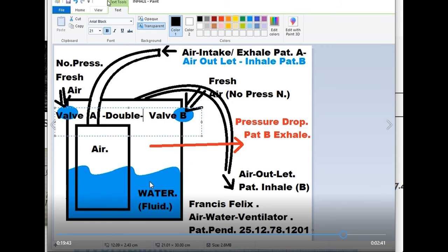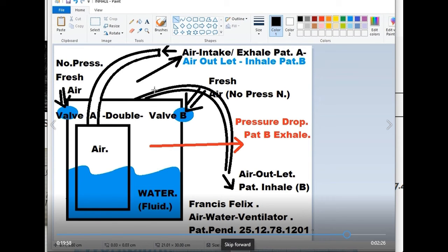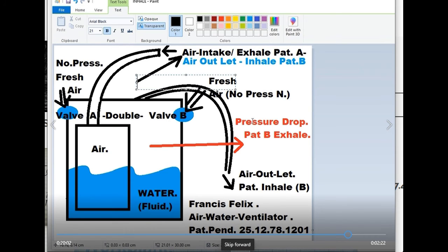And especially the magic is about the floating air. That's what the whole thing is. That means you don't need a lot of machinery, not a lot of springs and a lot of stuff. So I'm completing here now. And I'm saying that this is step 1.